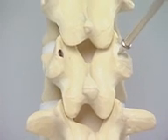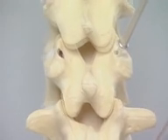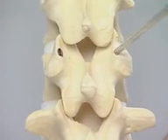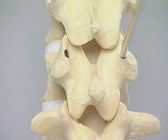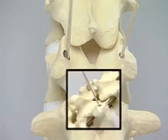This then can be opened with the pedicle awl and pedicle probe. The K-wires can be inserted. The medial angulation can be seen, and there is caudal angulation of these wires at T12.